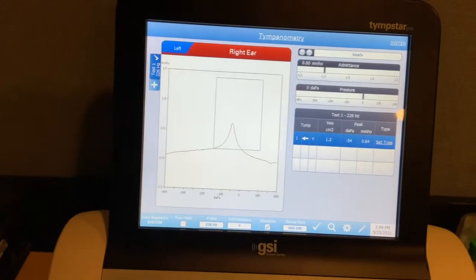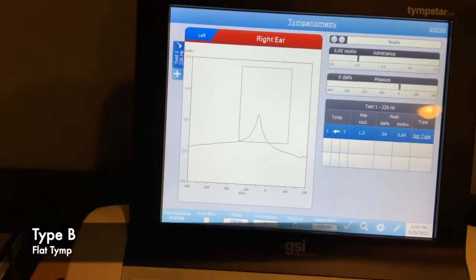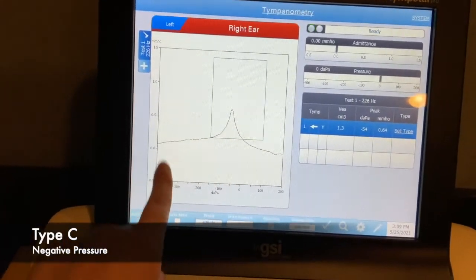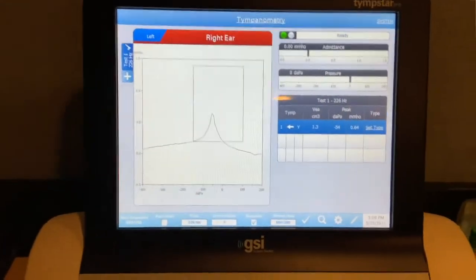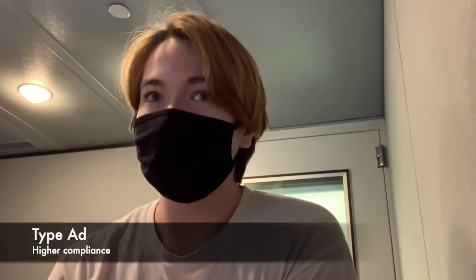Some abnormal types of tympanograms will be a type B, which would be basically a flat line across the screen, and also a type C, which would be a much more negative peak pressure from around 250 to 300 or lower in that range. A couple other types of tympanometric configurations are type AS, which is a lower eardrum compliance, and type AD, which is a much higher eardrum compliance. So you'll see those as well. Make sure to do both ears before you move on to acoustic reflex testing.